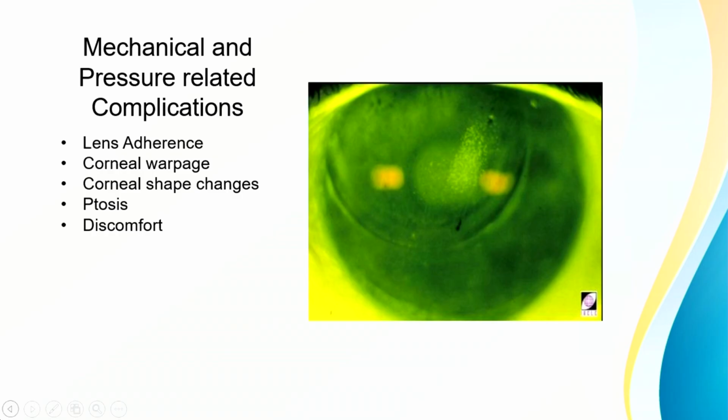The patient will have a good palpebral fissure. They'll be looking very good. But as soon as they are a prolonged user of corneal RGP lenses, they will have, maybe we'll say, a ptosis kind of appearance rather than a true ptosis. Can you think of the lens comfort and the complication?